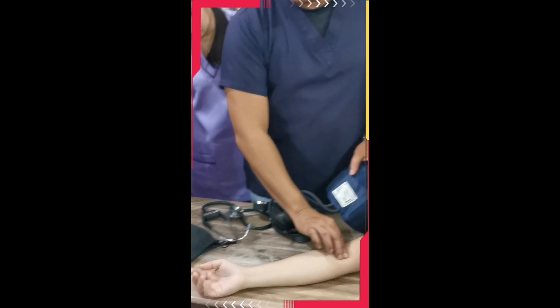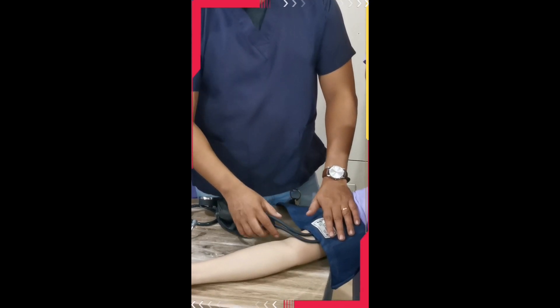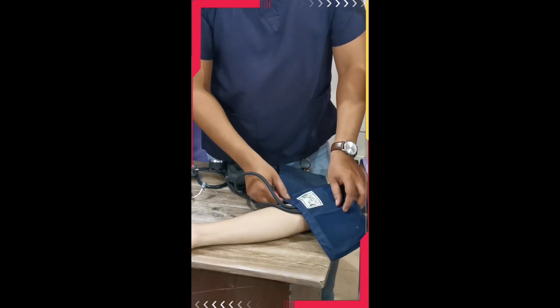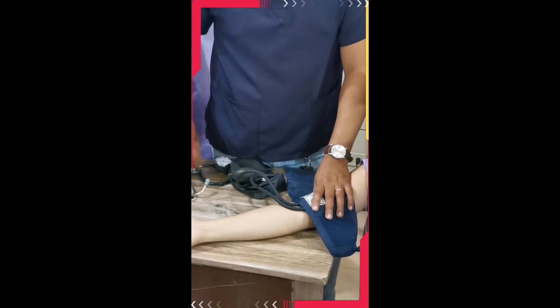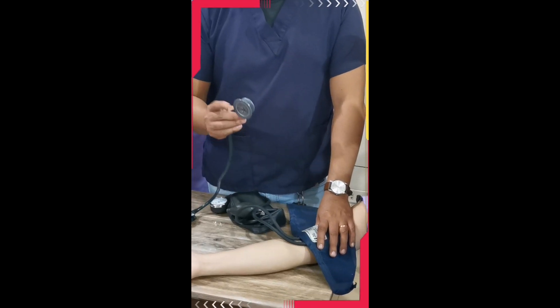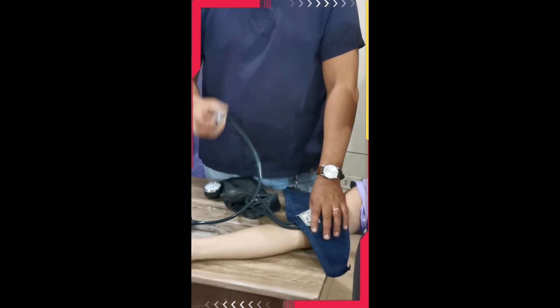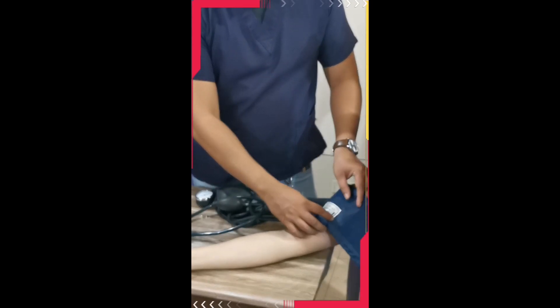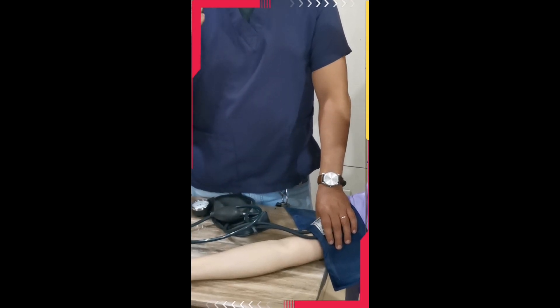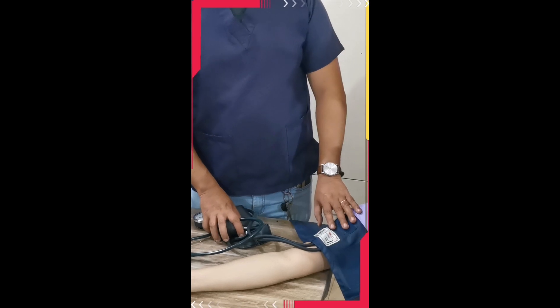There should be a one-inch distance between the BP cuff and the crease of the elbow. Do not insert the stethoscope under the cuff at the elbow crease — that is not the correct technique. Once you start to inflate, the stethoscope will be squeezed. There must be space for your stethoscope. That one-inch gap ensures that when you listen to the sounds, you hear the blood pressure — not sounds coming from the BP cuff itself.